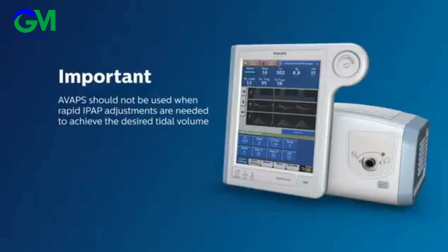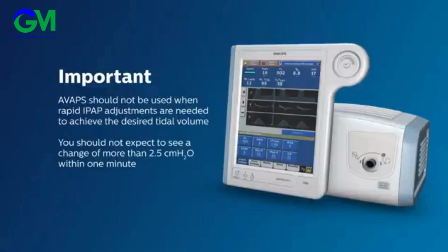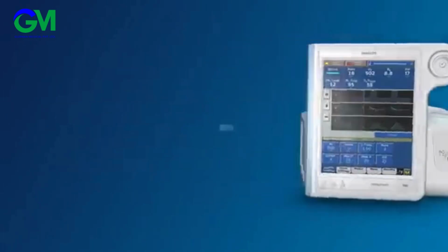However, AVAPS should not be used when rapid IPAP adjustments are needed to achieve the desired tidal volume, as you should not expect to see an IPAP change of more than 2.5 centimeters of water within 1 minute. So don't use it on all patients, but do use it on the right patients.